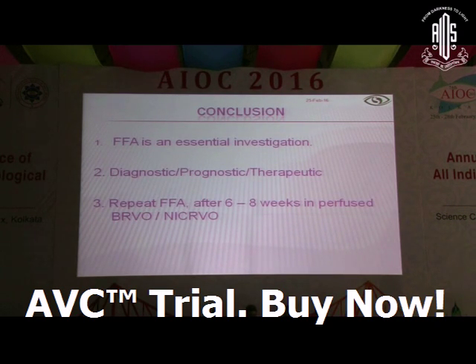So to conclude, angiogram is an essential investigation in the management of branch retinal vein occlusion or central retinal vein occlusion, or be it even a small macular branch retinal vein occlusion. It not only helps you in diagnosing the condition, but it also helps you in managing it. It has a therapeutic implication, as well as it can prognosticate whether the patient is going to behave well or not. And most importantly, let's not forget the role of repeat angiograms after 6 to 8 weeks, especially in perfused BRVOs and non-ischemic CRVOs.